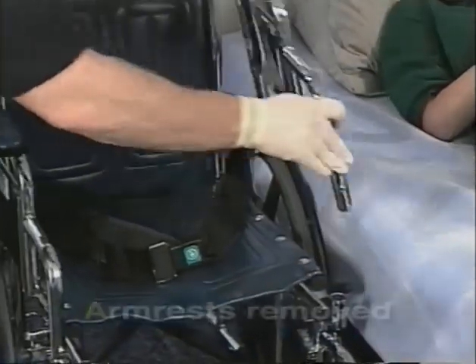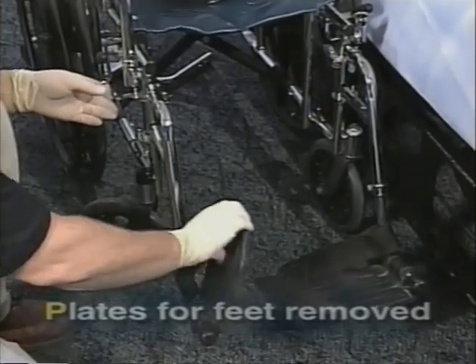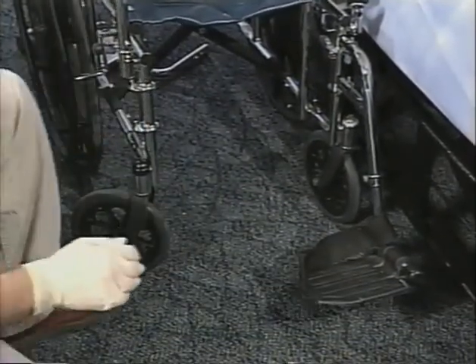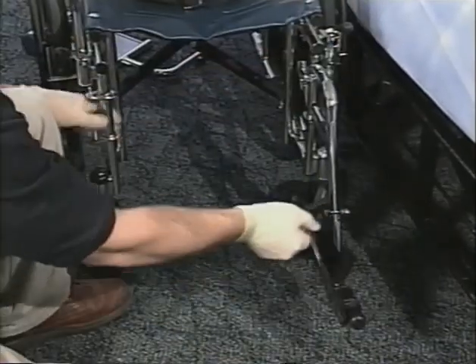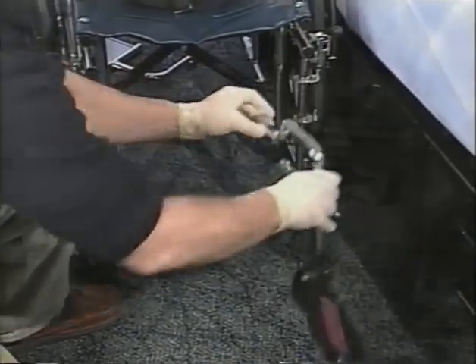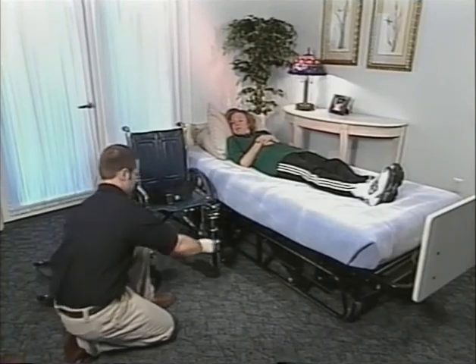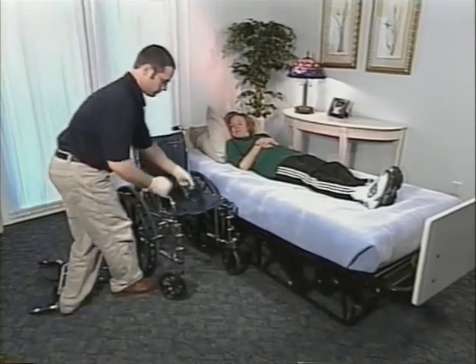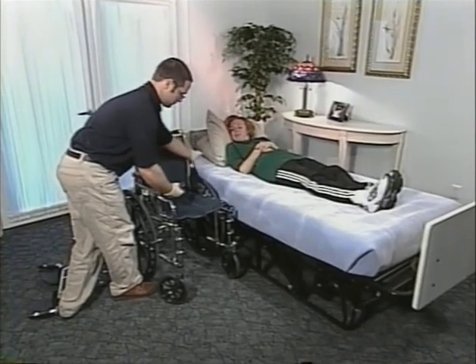Armrest on the transfer side is moved out of the way. Plates for the feet are removed or swung out of the way. Seat belt and other straps should be placed in an optimal position for refastening after the transfer is complete.